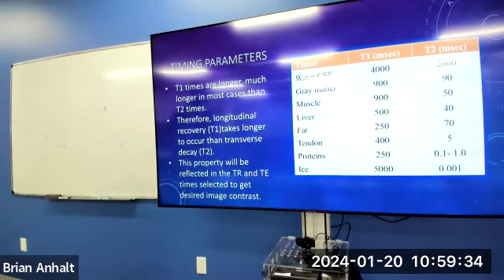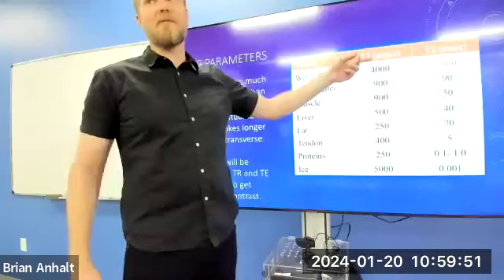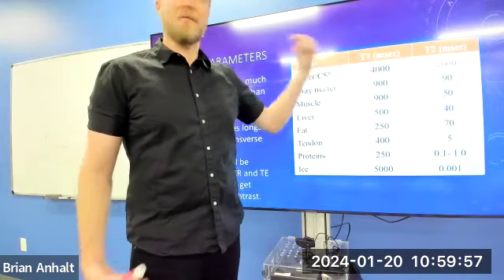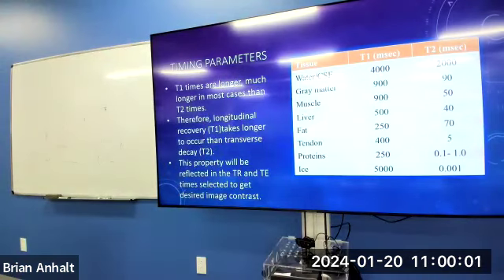Yeah, that's a good question too. So, yes, T1 was 4 seconds. That seems like a long time. Yeah, I mean, water takes longer for everything. And these times, like I said, aren't exact. You're gonna find different values in different books. I've heard before, it takes 16 full seconds for full longitudinal recovery of everything. It takes 16 seconds to get back to equilibrium. We're never really waiting that long for anything.